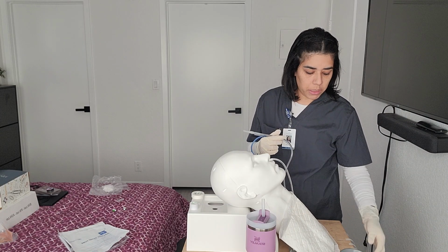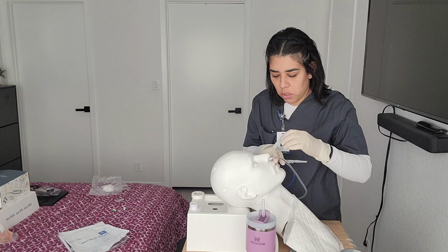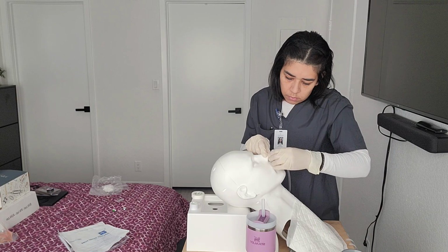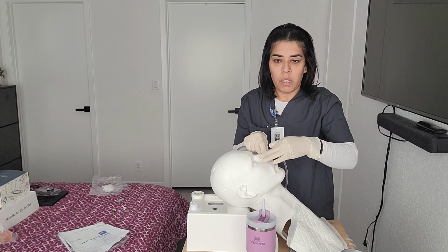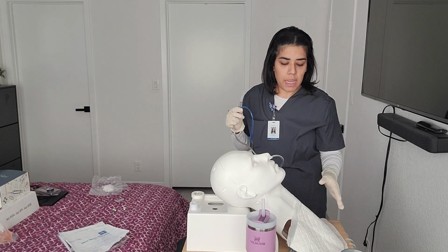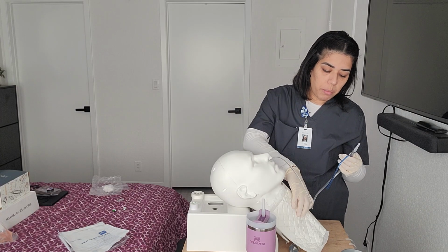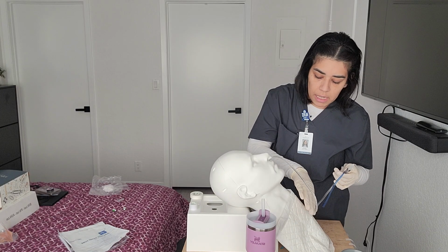All right, and now what we're gonna do is we're actually going to anchor the tube to the patient's nose. All right, so that's anchored there. All right. So while we wait for the x-rays, we have it clamped. While we wait for the x-rays, we're actually going to unclamp the tube, and we are going to check against the pH.